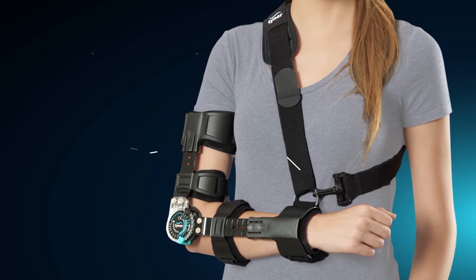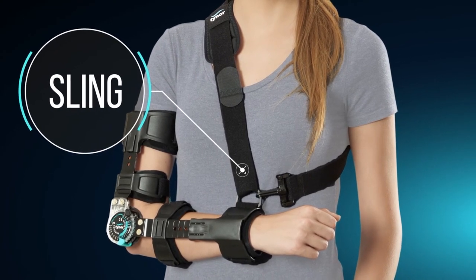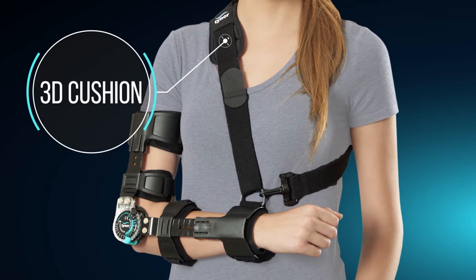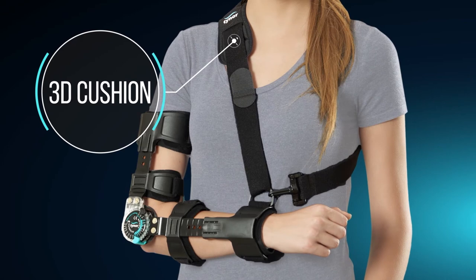In the design we have integrated a sling that is completely removable depending on the usage. This sling prevents fatigue of the shoulder muscles at an immobilizing angle. A 3D cushion is also given at the shoulder of the sling to ensure comfort while in use.